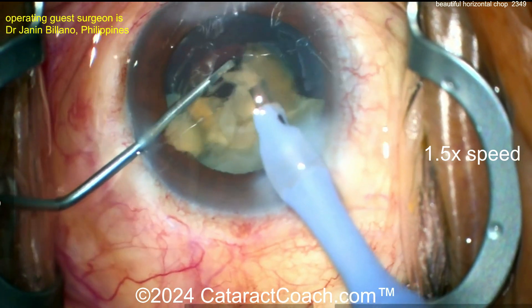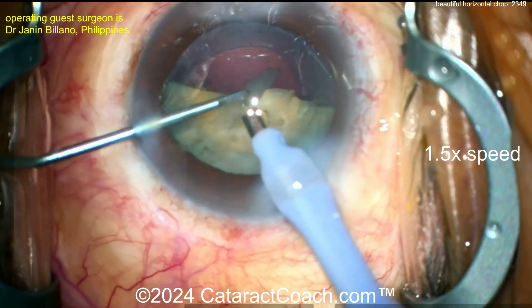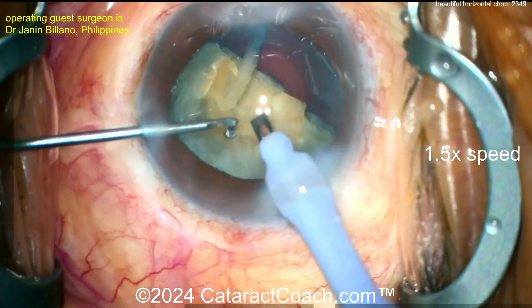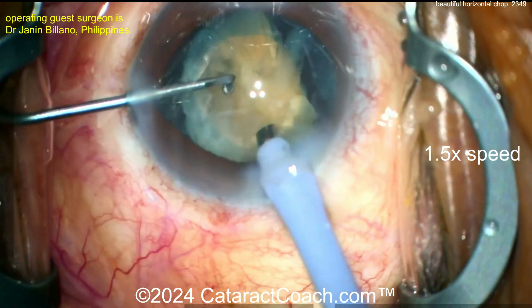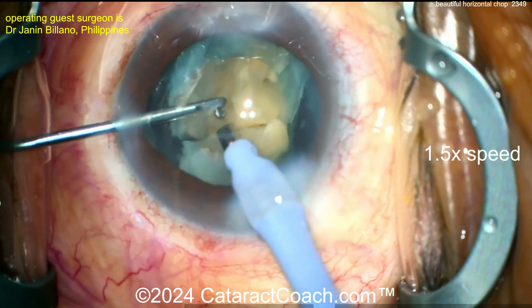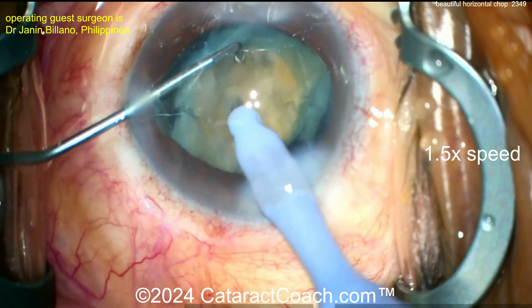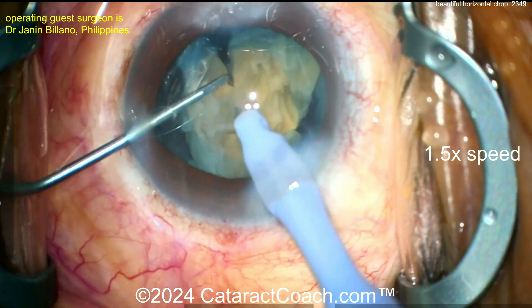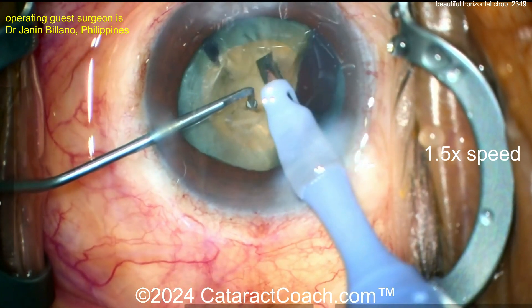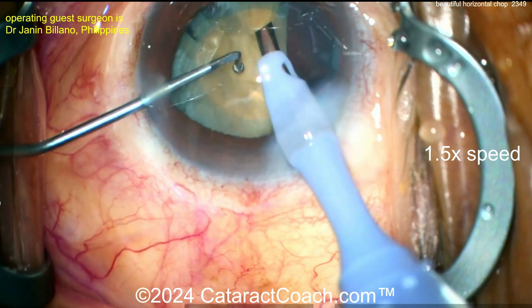Fantastic — here's another one. Now look in the bag — all you have left is the hemi-nucleus. Not a lot of cortex in this case, by the way. It's a pretty dense cataract — good density here. Depending on where you are in the world and your training program, you may see much denser cataracts, but this is a nice density for learning chop, because you'll get nice propagation of the chop and good holding power with the phaco probe. If the nucleus is too soft, you buzz and you have only a fraction of a second of holding power before the nucleus crumbles. With more density like this, it's a lot easier to maintain that vacuum holding power.